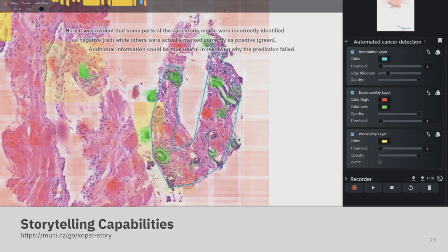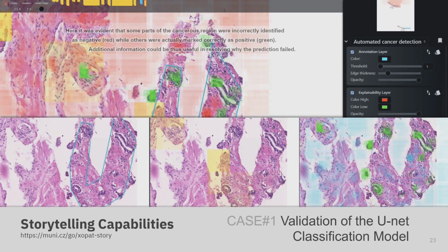Users can share stories that enable to animate both the visualization and annotation objects, text in this example. The storytelling plugin is used to animate the story of use case number 1. Here, an analysis researcher views individual layers from files: a ground truth label provided by a pathologist, turquoise borders, a network prediction, yellow opacities, and a diverging XAI occlusion, in the top part drawn as an opacity heat map in red-green, and blue-green in the bottom right.